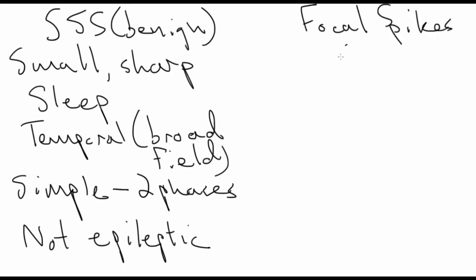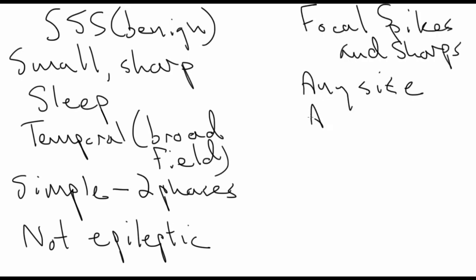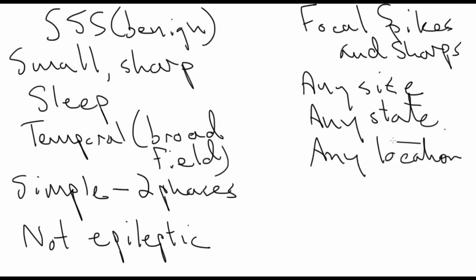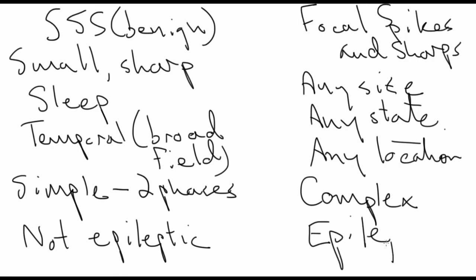In contrast, focal spikes and sharp waves can be of any size. They can occur in any state and any location. They often have a complex or multiphasic morphology, and they do indicate underlying epilepsy.